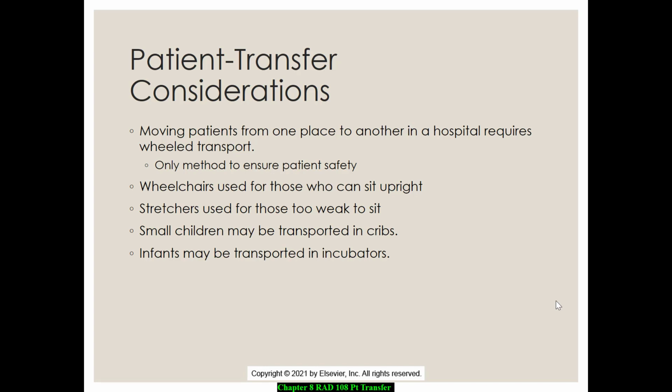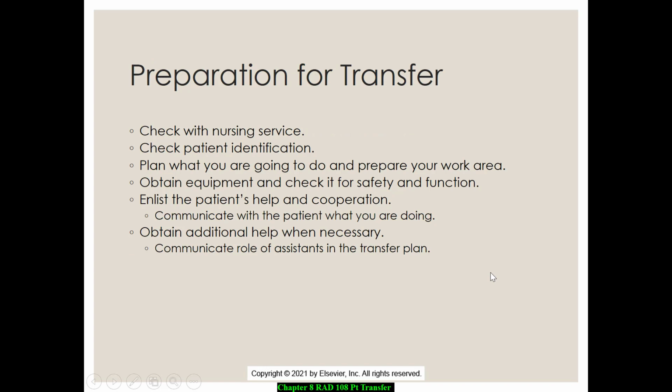Some of the transfer considerations that you need to take place of is moving patients safely across the table. So we're going to work on transporting our patients. How do you use a wheelchair for transferring your patient? How do you use your stretcher? How many people do you need to pull your patient over on the stretcher? And we're going to take a look at some videos that show you how to properly use those transfer techniques.